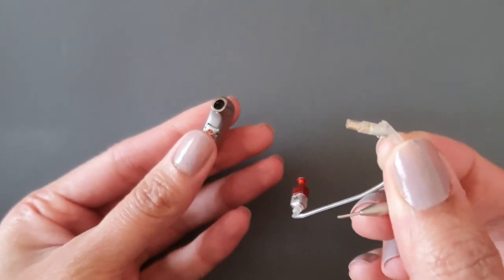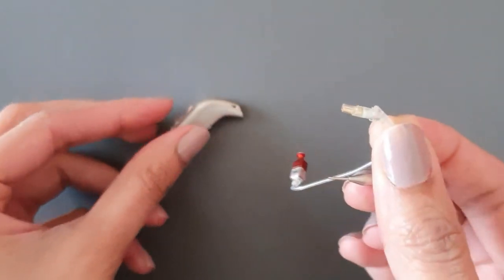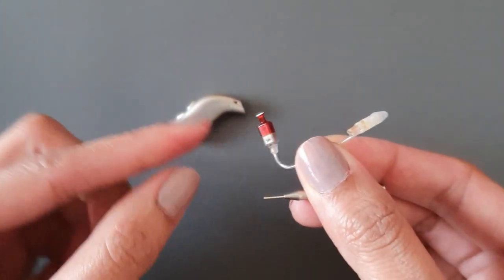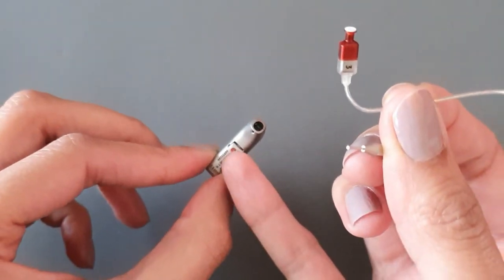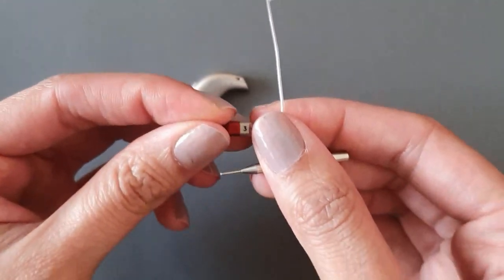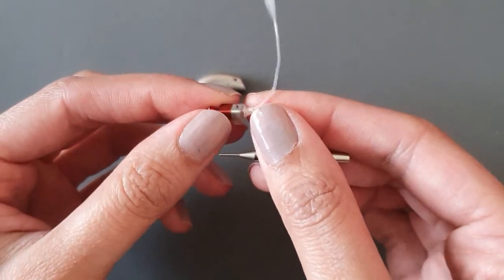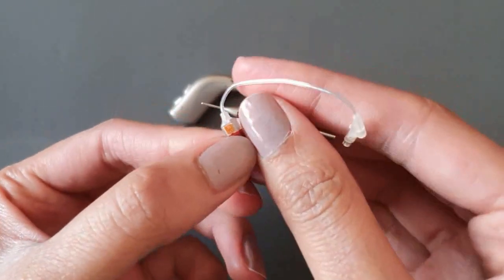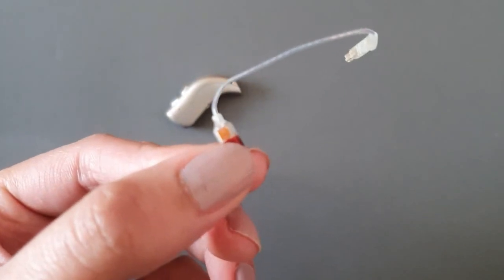To put your new speaker wire in, you would first need to check you've got the correct speaker wire. This is the right speaker wire as indicated by the red color, to go into my right hearing aid which has a red marker on the end. They come in different sizes and strengths — this is a size three speaker wire and this is the 85dB speaker.